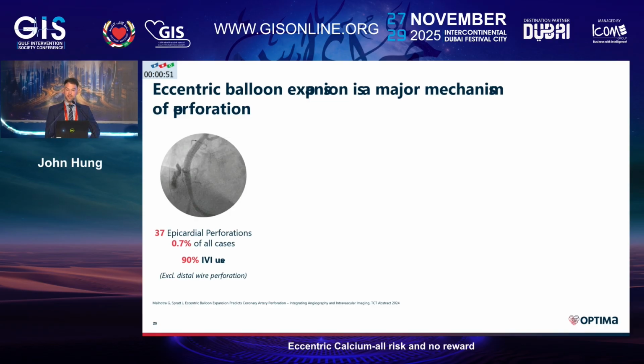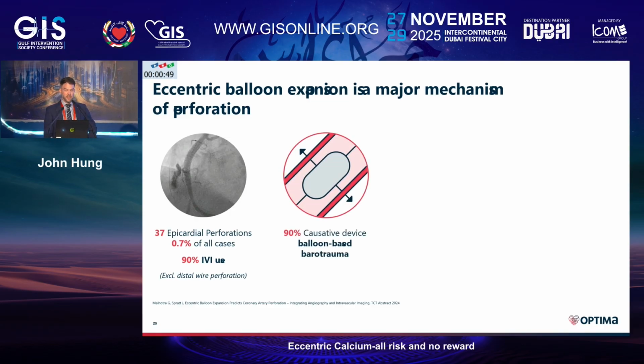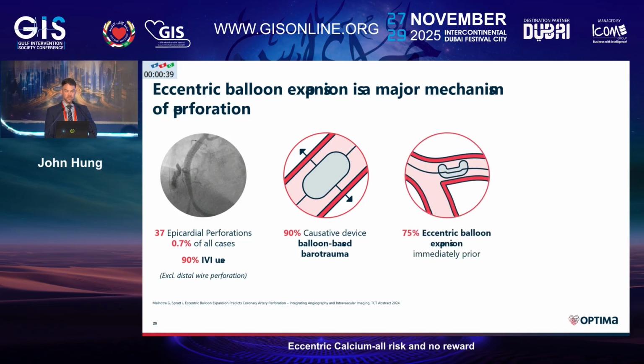They did a lot of imaging to assess them, of course, and they found that when a perforation occurs, exactly 90% of the time, the causative device was in fact just the balloon. And if they went back a step, they would see that just before the perforation occurred, 75% of the time, the balloon had been expanded in an eccentric fashion.